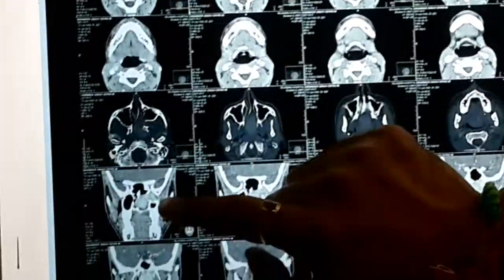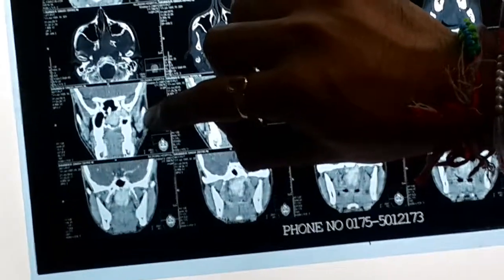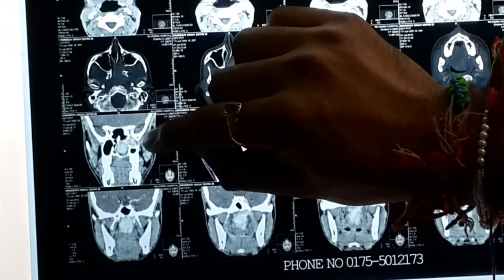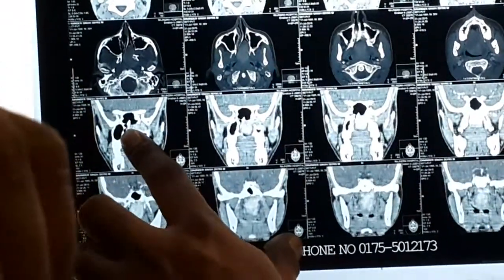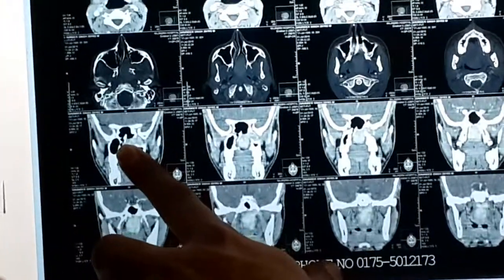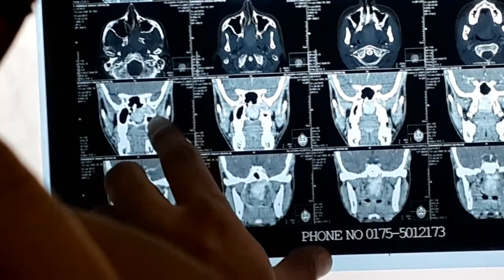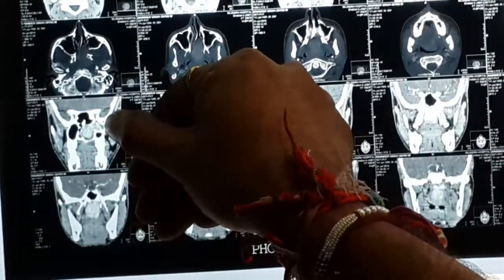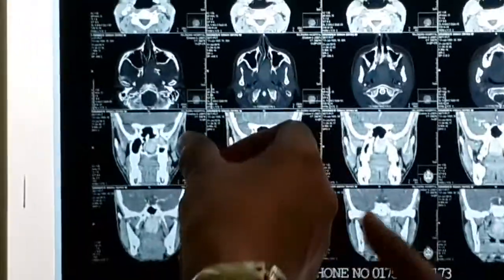On the coronal, we are seeing one by one. This tumor — now see the tumor, differentiate it from the normal structure. This is the temporalis muscle, this is your mandibular condyle and ramus, this is the temporalis muscle coming to the coronoid process, this is the lateral pterygoid muscle. See this contrast-enhancing tumor — it's a contrast scan. Can you see the tumor enhancing? This is the tumor in the pterygopalatine fossa. And see, there is a good plane between the tumor and the normal muscle.